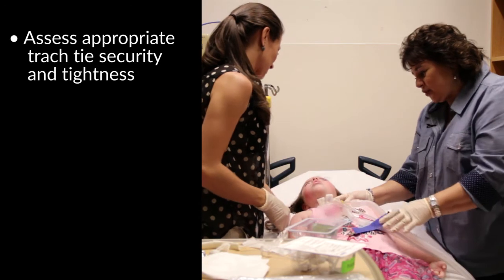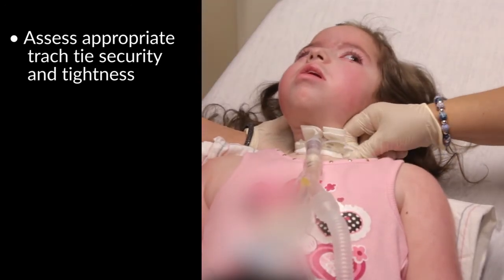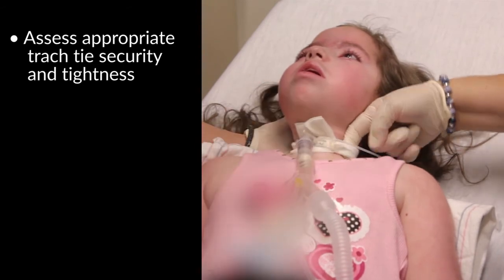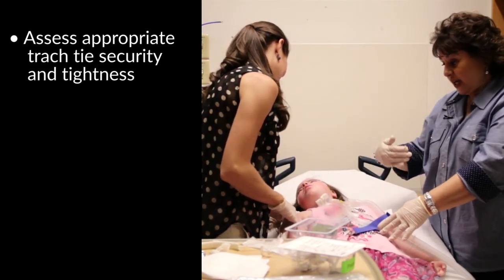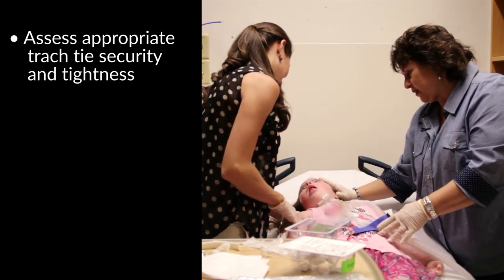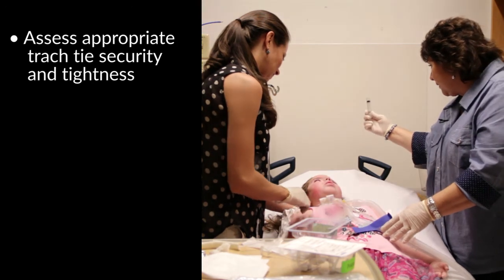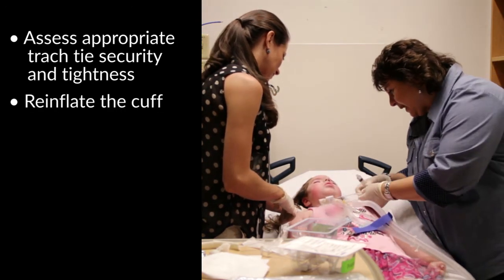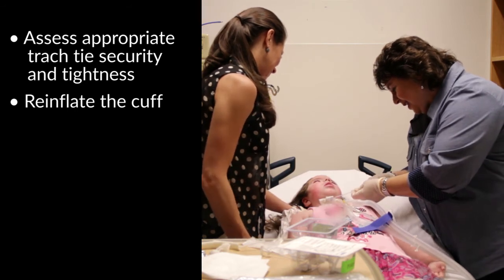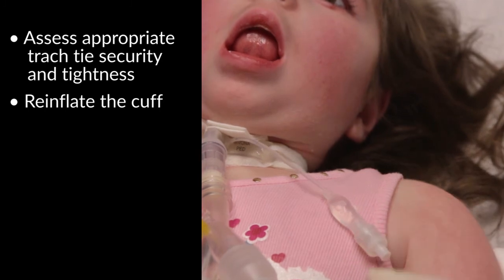Okay, so now that we have the trach tie in place, I'll put my finger under there and, ooh, a little bit snug, but I've got my 1 adult finger underneath. So we want to make sure it's not too loose, allowing it to fall out, and not too tight, keeping her face red all day, right? And I have the water, 2 cc's of water. This was in your balloon before. I'm going to put it back in, okay? And you'll still have your voice, though. Okay? We'll take that roll out.